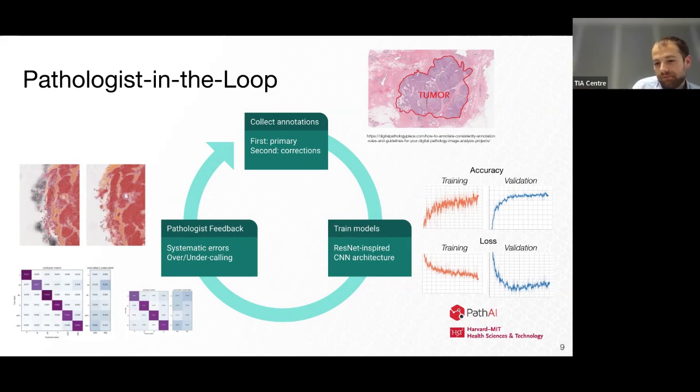So I'm asking, this pathologist in the loop process, which is really nice, we are still talking about annotation curation, right? So you're not talking about when you did the prediction on the whole slide images, on all the cancer whole slide images, you know what I mean? This is just for creating ground truth annotations. Annotations, okay. Yeah. Is this only for ground truth annotations, the pathologist in the loop process?